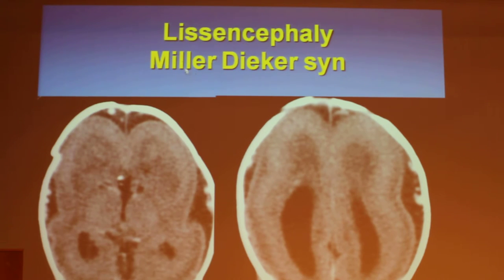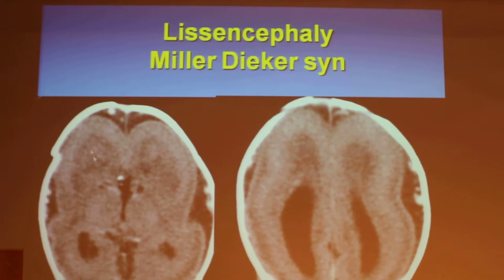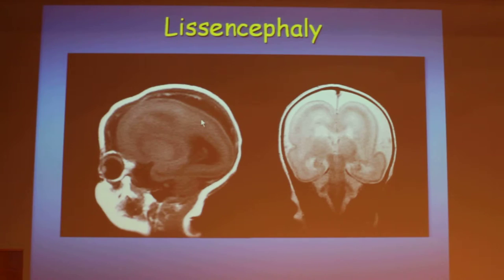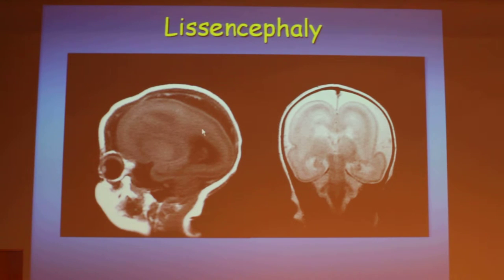On CT in the Miller-Dieker syndrome, again the figure-of-eight brain, and we can see that the cortex is definitely abnormal even though this is just a CT. On MR, very flat, smooth outline of the brain tissue, and on coronal imaging, the figure of eight.